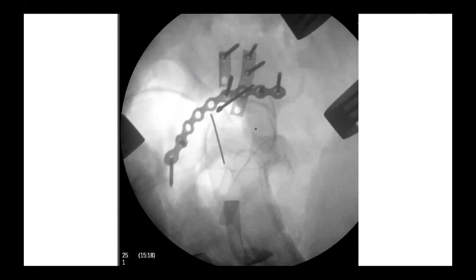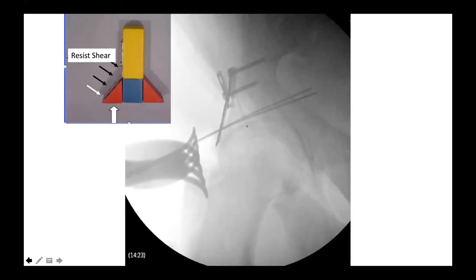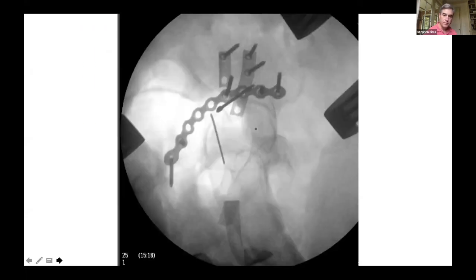Particularly with the comminution that you have of the inferior posterior wall, it'd be really easy to have the femoral head still sitting a little lateral, and the superior fragment would look reasonably good, except on an AP X-ray you'd see a gap in the roof. And I think you saw that initially on some of your earlier fluoro shots. Yeah, you still see just a little bit there, too. It's still a little bit lateral, and you can see a little gap there as well. We were hoping to close that down with lag screws and with the final buttress plate that we put on top, which I think we basically did.